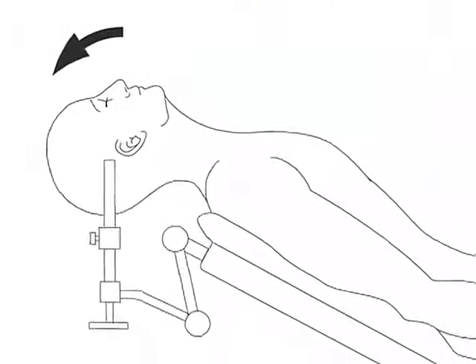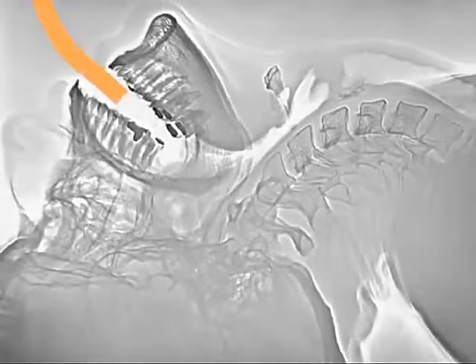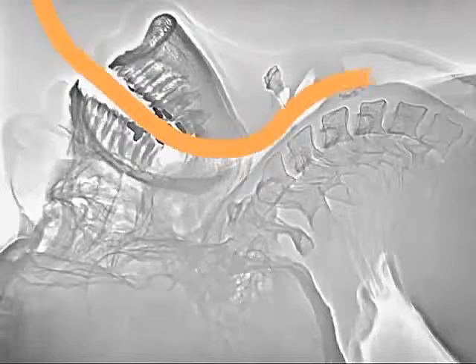In cases where there is abnormal positioning of the patient, especially the head and neck, it is advisable to use a reinforced tube. A stylet can be placed down the reinforced tube and the tube shaped into the particular shape needed by bending the stylet inside the tube, making intubation in a difficult situation a little easier.